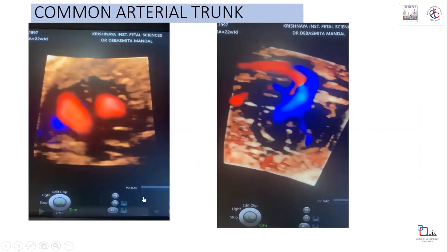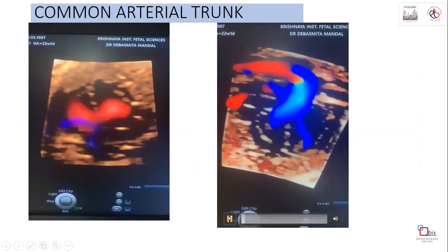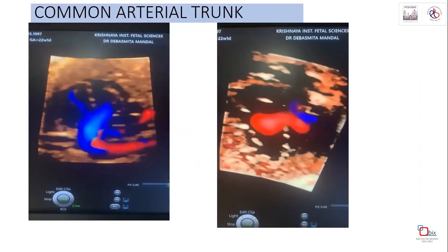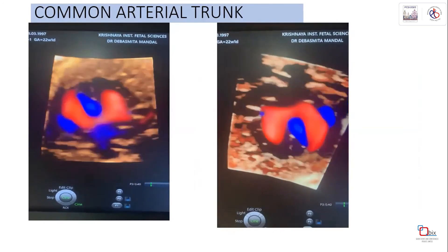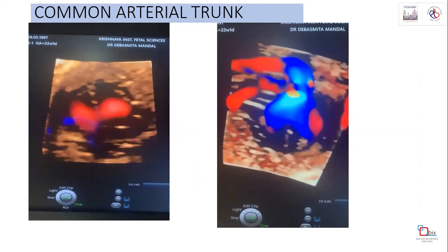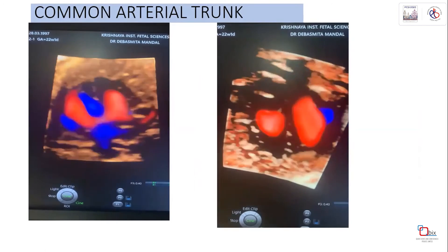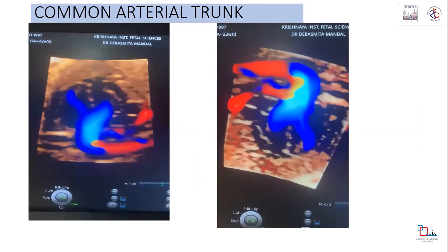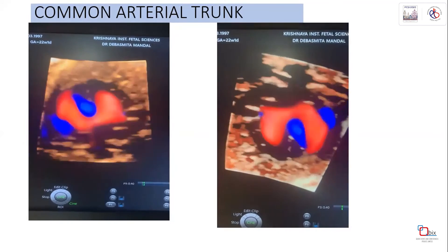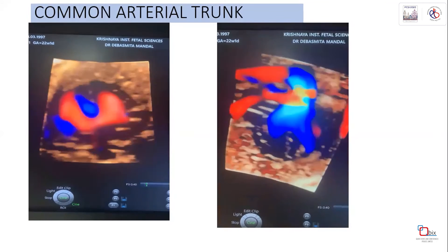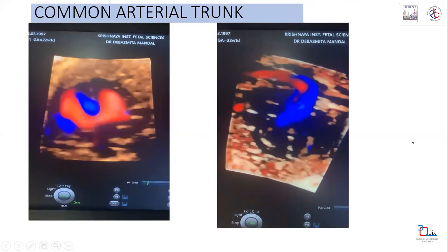This is a rare case of common arterial trunk (truncus arteriosus) diagnosed with 4D color Doppler. The color was imposed on the 4D dataset, revealing that the pulmonary artery was arising above the truncal valve - something that could not be determined on 2D imaging despite significant effort. Only after adding color Doppler with 4D was the diagnosis of common truncus confirmed.